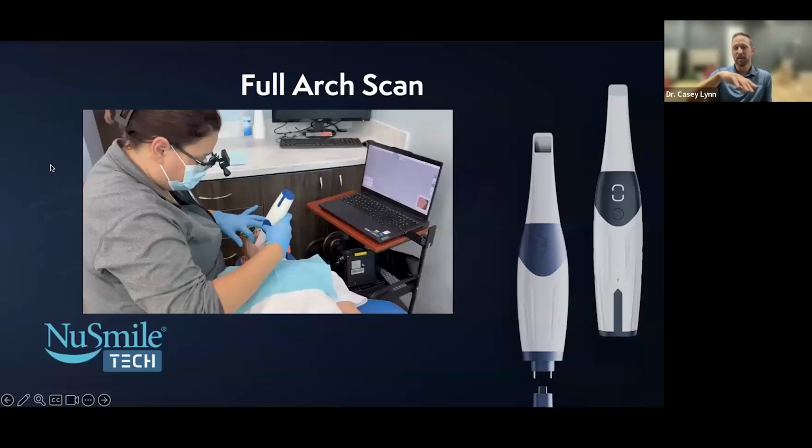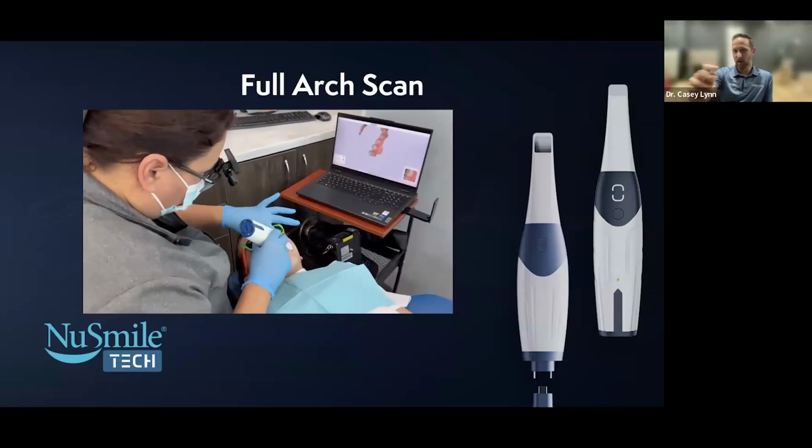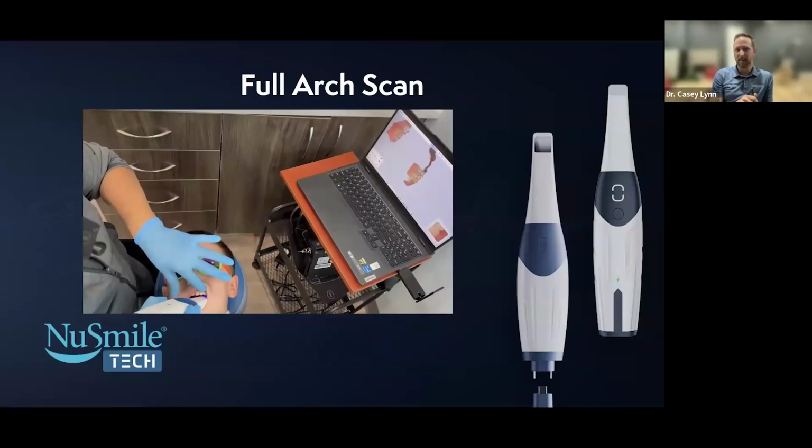Now, this is my assistant, Angelica, doing a full arch scan. She's rolling through the maxillary and mandibular scan, and she'll get a bite, which will give us our occlusion. If you are doing something more than a single arch impression, you can gain all that information and use it for ortho aligners, multiple arch appliances, or some more phase one or orthodontic needs where you need all of that integrated in. We have this sped up, and I'll walk you through some of what she's doing. We have a little laptop table with some of our stuff on it that we just roll around the office as needed.